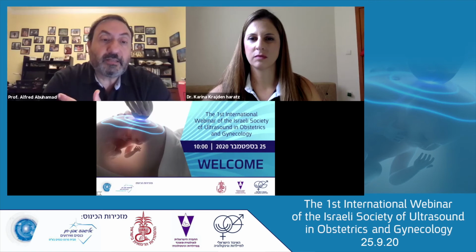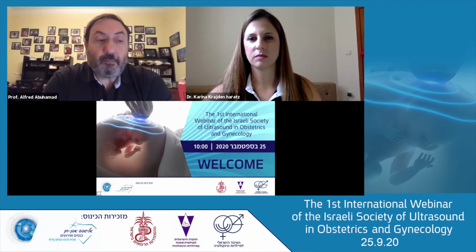Color Doppler is essential, in my opinion, in the first trimester to do cardiac screening, to get it at the 4-chamber view and the 3-vessel trachea view. Pulse Doppler, I would say no for cardiac screening, unless you suspect an abnormality. Certainly yes, as part of the fetal echo exam.